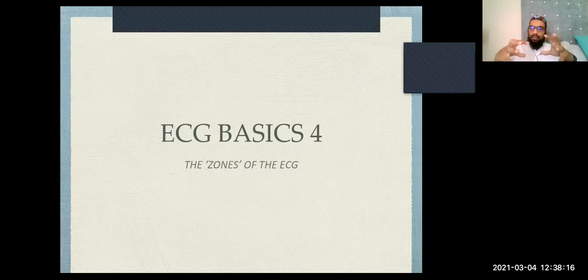So it's kind of like me getting 12 of you and putting all around me. Everybody will be standing from a slightly different point of view and giving a description of my face. And when you give a description of my face, you are just giving from your point of view, but put them all together, and that's when you get a full picture. However, if I, for example, were to put three people in front of me here, their description of me would be similar, but not exactly the same because they form one zone. And then if that's comparing to somebody who's at the back, they'd be giving a completely different description of my head. And somebody who was there would also be sharing a similar description with them.